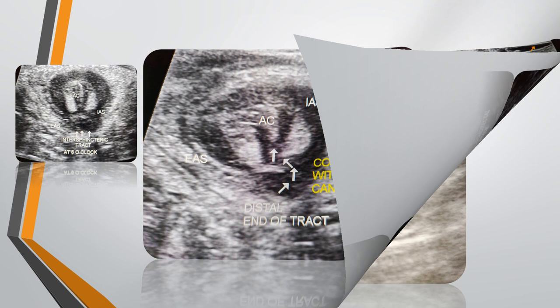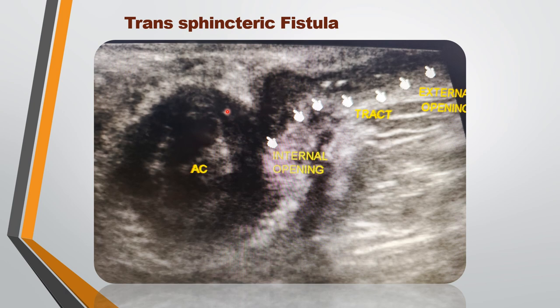The axial section of the anal canal shows the internal sphincter, the external sphincter, and a linear hypoechoic tract arising from the anal canal at about 2 o'clock position, extending laterally and opening into the external opening site. This is an active tract. The tract courses through the external sphincter — it has crossed the intersphincteric space and the external sphincter. This is therefore a transsphincteric type of fistula, with no abscess around the tract.